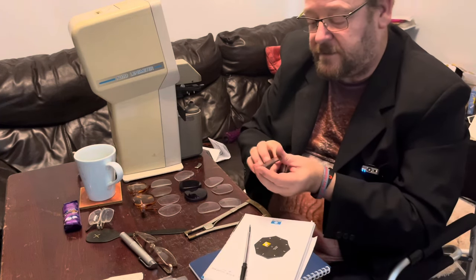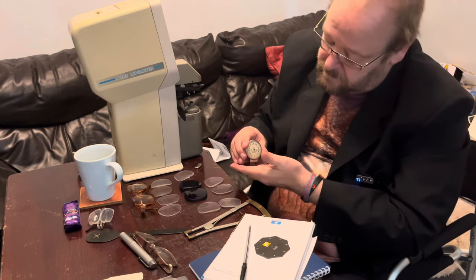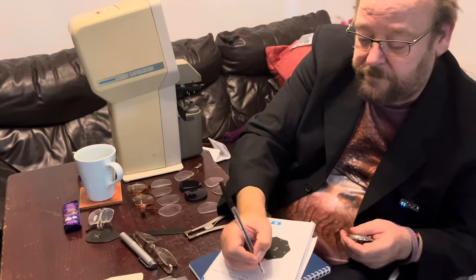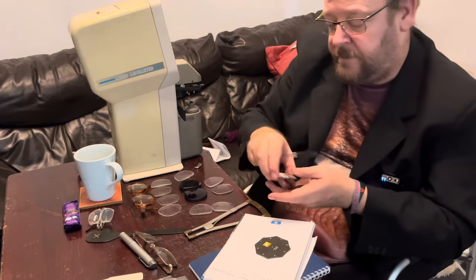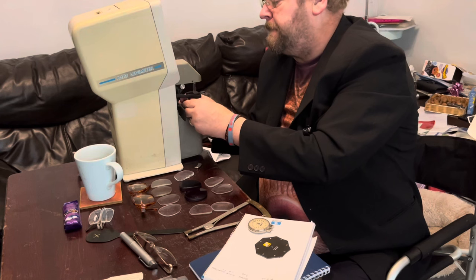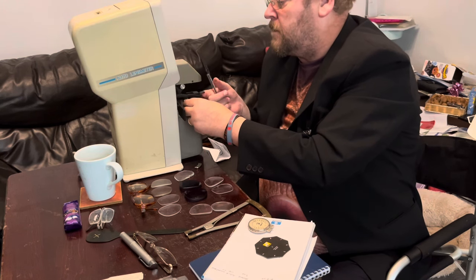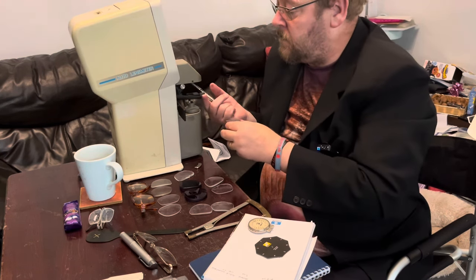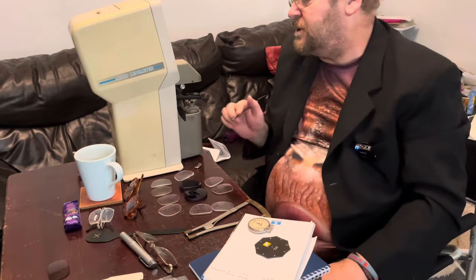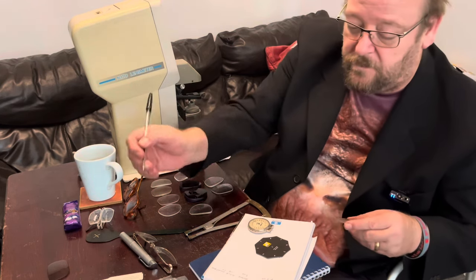Now I measure the front surface and that measures as plus five. I'll just have a look at that on the focimeter — there's a malfunction on the focimeter. So we mark that as lens A.